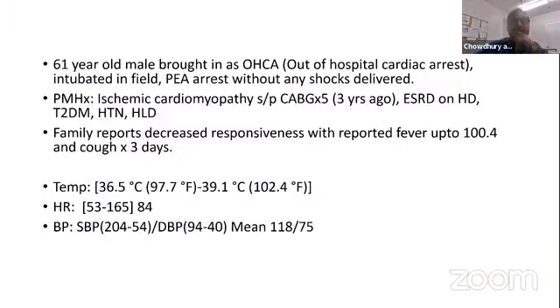And this is the clinical context. Cardiac arrest, PEA arrest, and the patient is known to have ischemic cardiomyopathy, CABG, end-stage renal disease, and then came to us following the cardiac arrest.